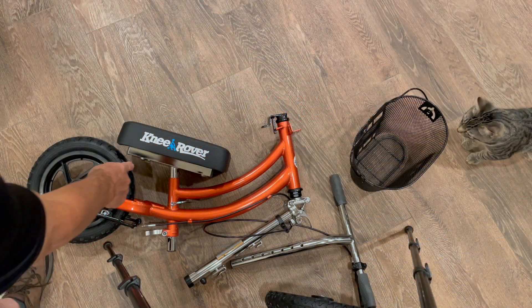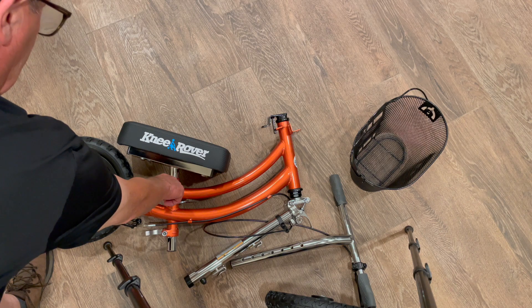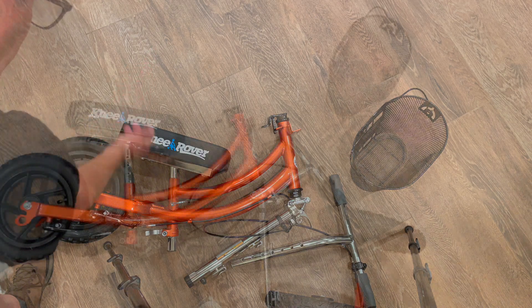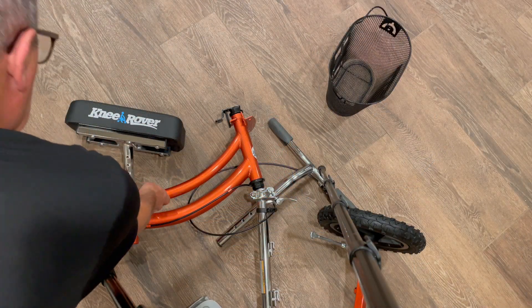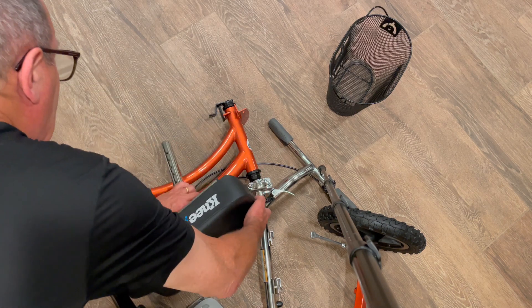Don't let this throw you, but take a look at this seat. It's not assembled properly when it's sent to you — they put it in upside down so they can ship it easier in the box. What you need to do is take the seat out and then shove it in the other way.